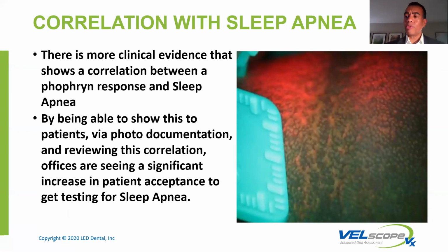One of the things we want to do is some further assessment, fill out an evaluation, Epworth score, what have you. And then the only way to confirm is to get a sleep test. But again, it's that visual interaction with the patient to show them this could be indicative of sleep apnea, this red color, that, from the feedback we're getting from doctors, helps the patient understand or connect the dots that this could be associated with a life-threatening disease.